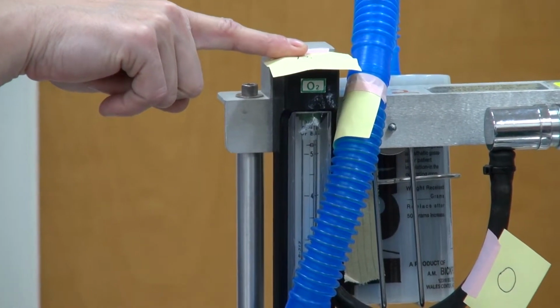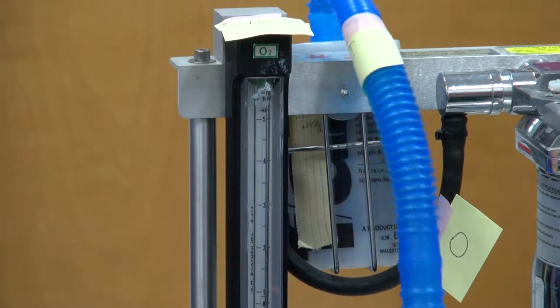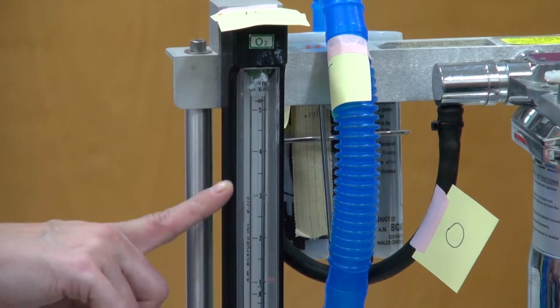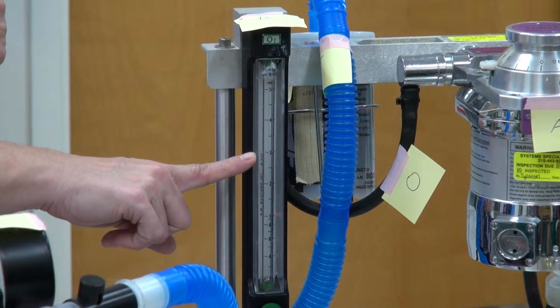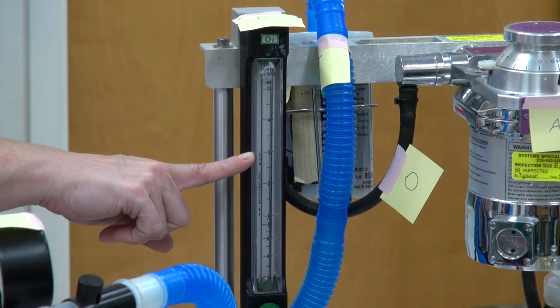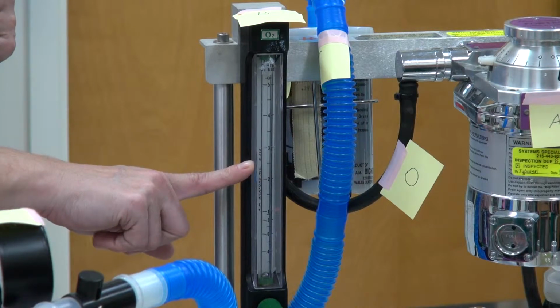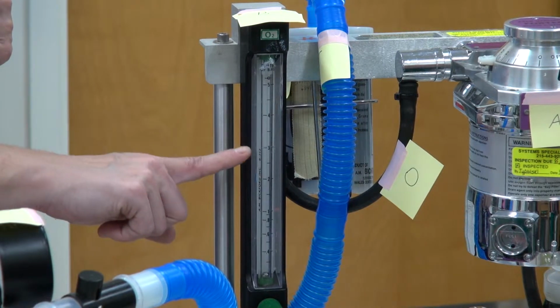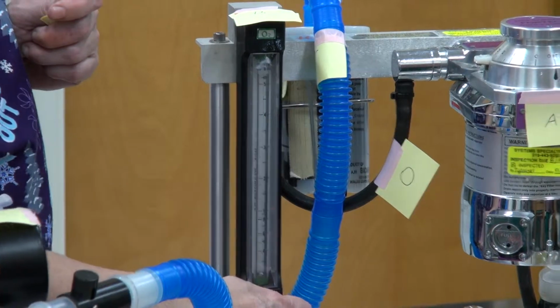It's our flow meter. What is it measuring? Oxygen, correct. When we are calculating our induction for oxygen, what is our calculation? Weight times 10 times 6. That is for induction. For maintenance, we are weight in what? Kilograms. Yes, in kilograms times 10 times 3. Correct? Okay. This is our flow meter.